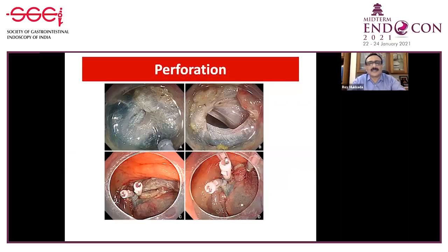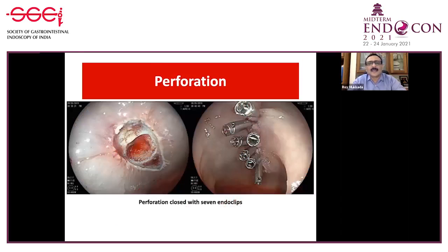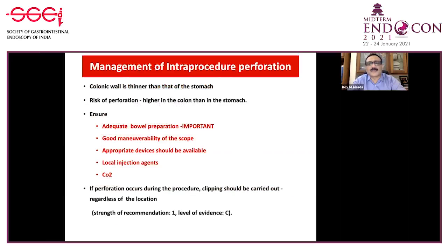You see this, then you can mistake it for the muscle. If you think that it is muscle and then cut, you can create problems, and then you have to close it by clips. Again, this is another perforation which is closed by clips.